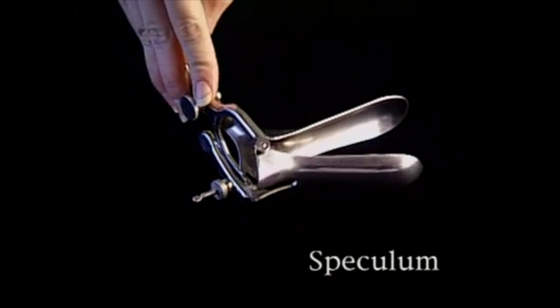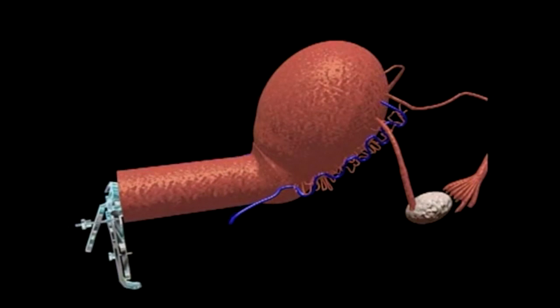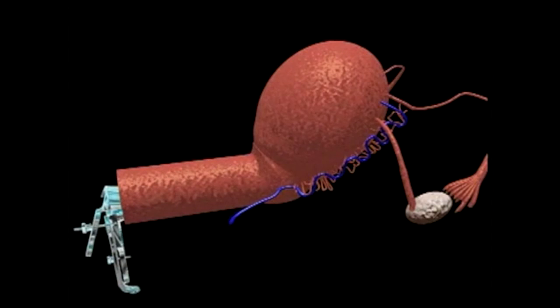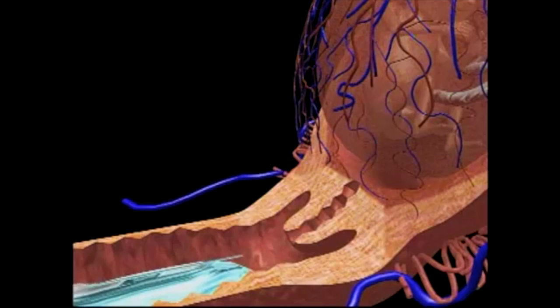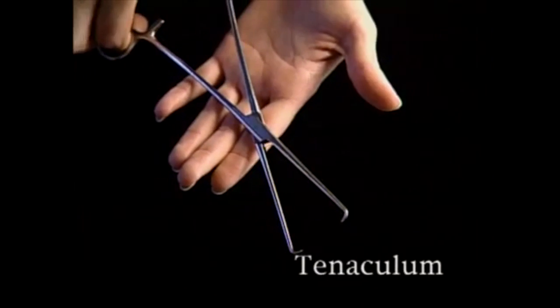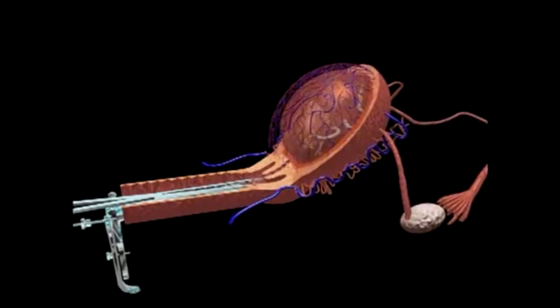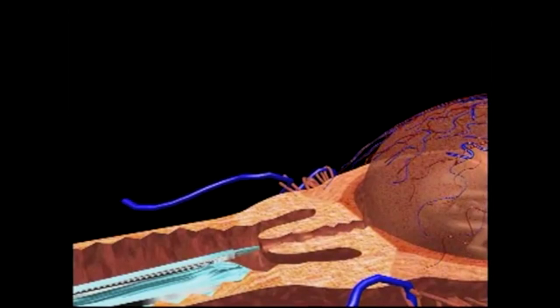Suction curettage is the type of procedure most frequently used to accomplish abortions in the first trimester. This procedure begins with the insertion of a speculum, which enlarges the opening of the vagina. After painkillers, normally lidocaine or xylocaine, are injected around the cervix, a sharp grasping instrument called a tenaculum is locked onto the cervix and pulled until the uterus is brought in line with the vaginal canal.